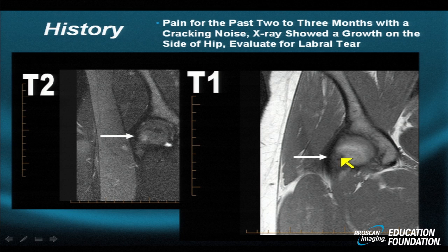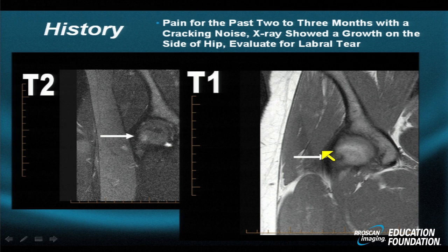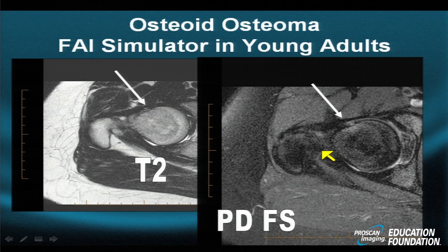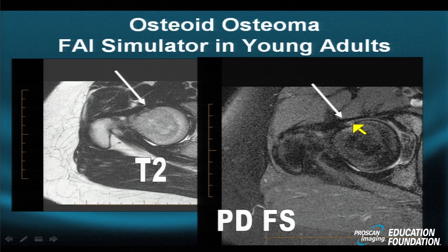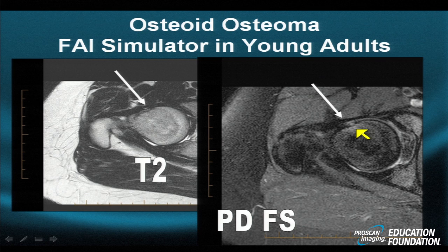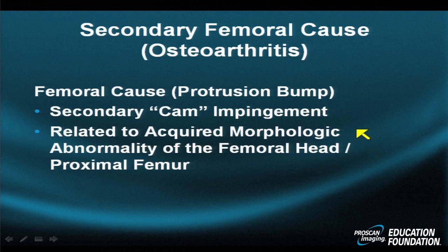It's an osteoid osteoma with a nidus. On the T1-weighted image, in no way does it resemble water — it has a signal much closer to that of muscular tissue. Beware of this pitfall, especially with the epidemic of FAI diagnoses we see today in athletic young individuals. Look at how similar the intracortical nidus of osteoid osteoma looks in location along the femoral neck on T2-weighted and proton density fat suppression images, but it's not truly cystic — it's not a smooth round structure with a rim and pure water in the center; it's much more bland and intermediate in character.